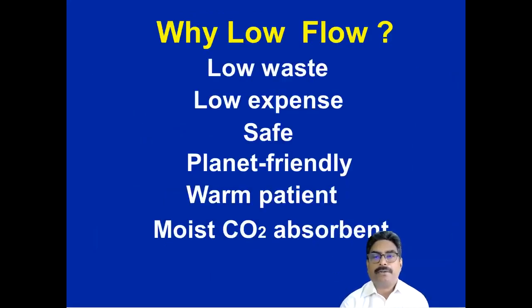Why do we have to practice low flow anesthesia? Because in low flow anesthesia, there is a low wastage of inhalation anesthetics, and so there is low expense on the cost of inhalation anesthetics. And also it is safe for the theater environment and the environment in general, it is planet friendly, and it warms the patient and moistens the carbon dioxide absorber.